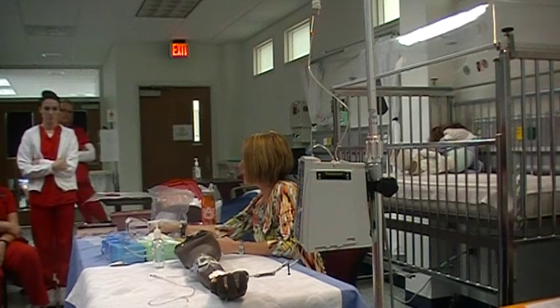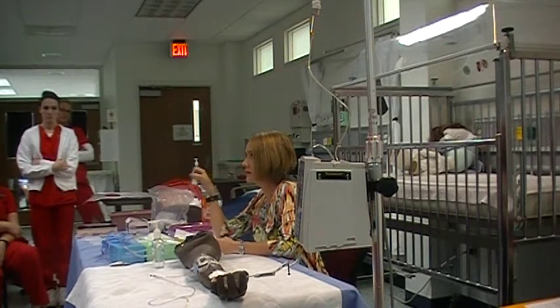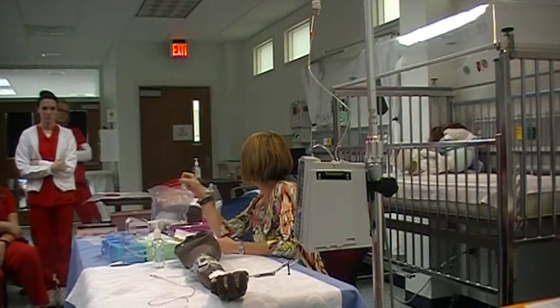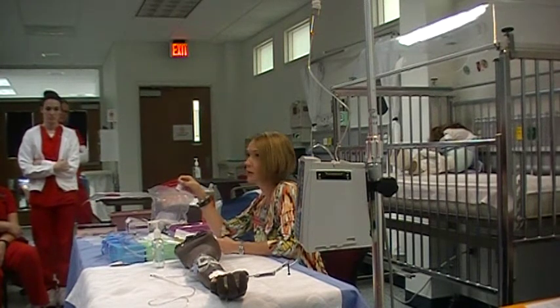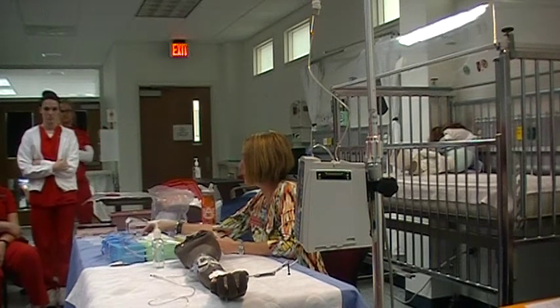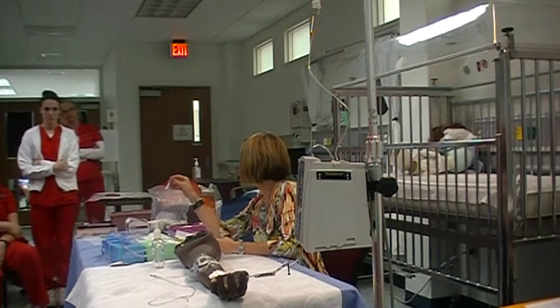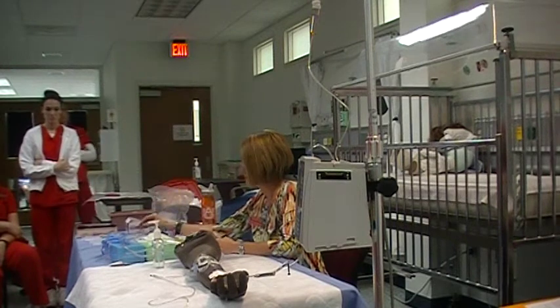There are going to be needles here that you're going to use to draw it up. Remember, just because it looks like this is sterile water, it's not normal saline. So pay attention to what's on the table, okay? It could be different types of fluid up here. And if you need it, like Protonix, it needs to be mixed with normal saline. So if you pick up sterile water and use it, that's not what we need. We need normal saline, okay?